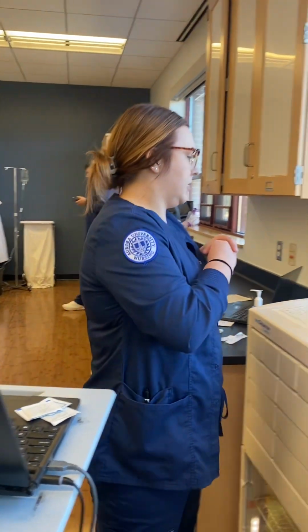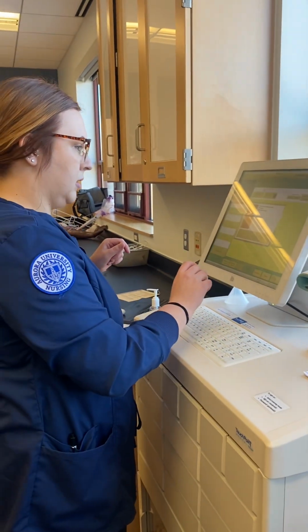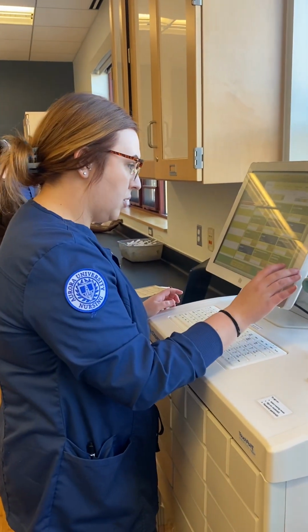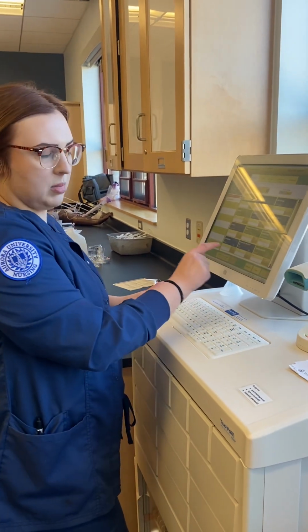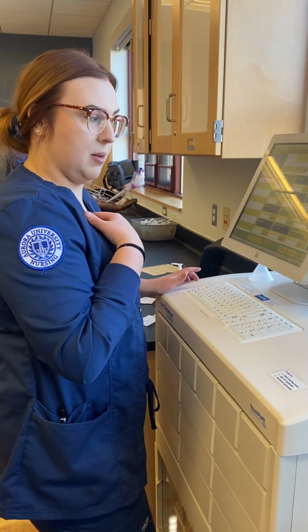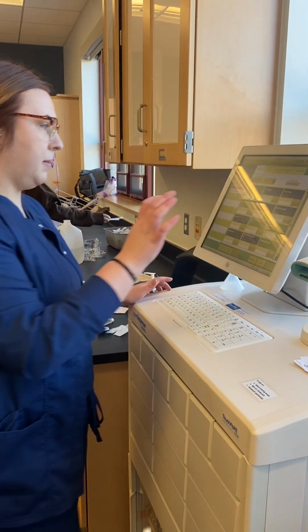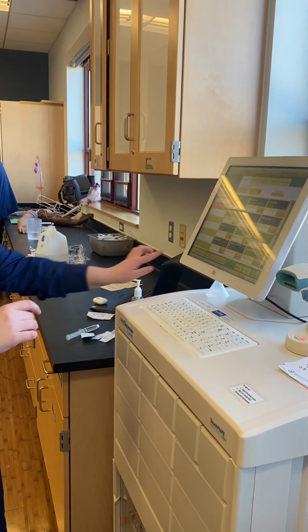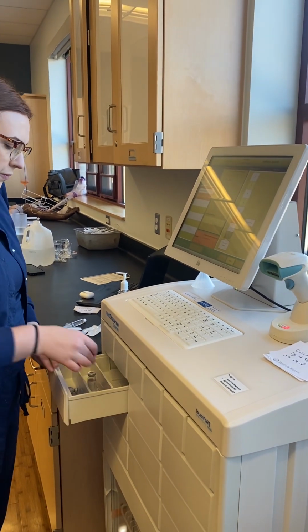So I go to my Pyxis. I find my patient. I'm going to find furosemide. So it's 100 milligrams in 10 milliliters. I only need 10 milligrams, so it'll be 1 milliliter. But that is my medication. So I'm gonna pop that out. One, enter, retrieve. Okay, so it pops out.